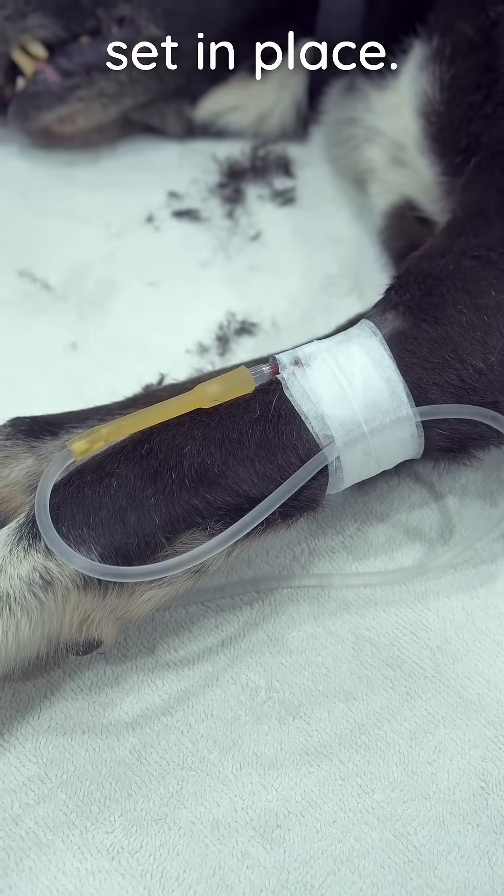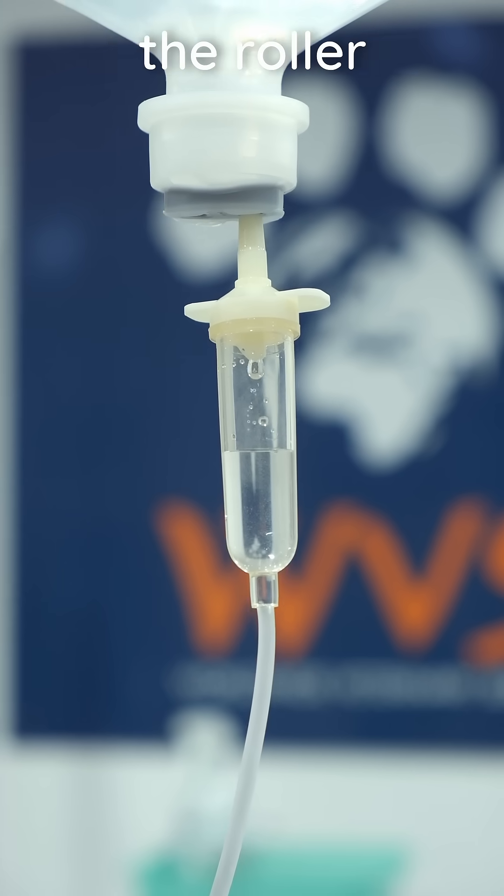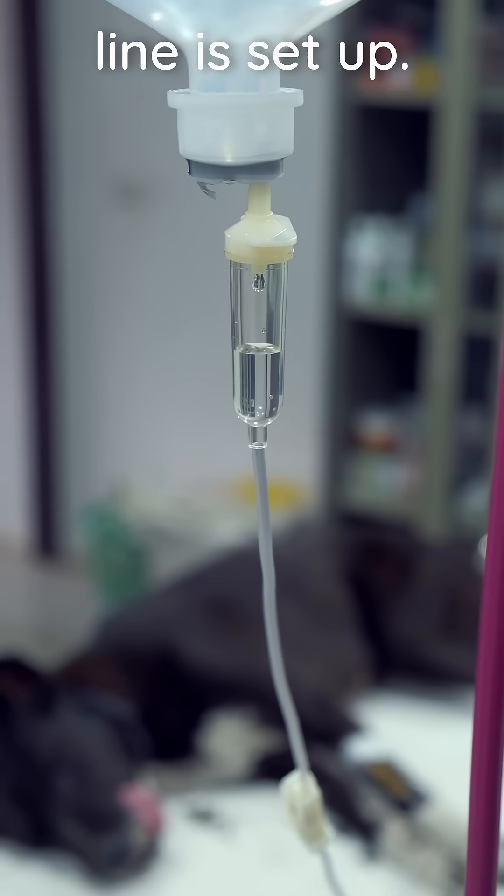Use tape to secure the set in place, then slowly open the roller clamp to ensure fluid flows into the vein. Finally, adjust the roller clamp to the calculated drip rate and your line is set up.